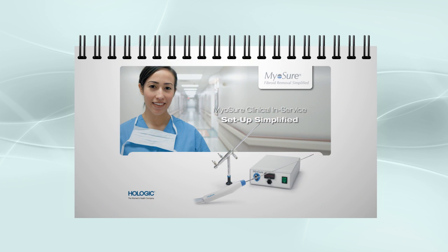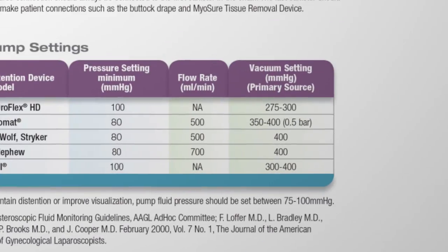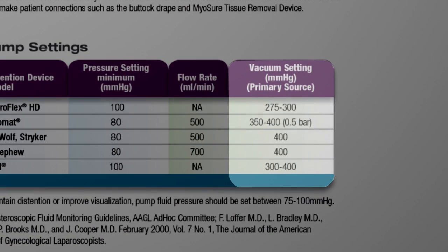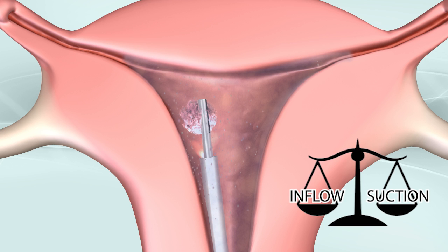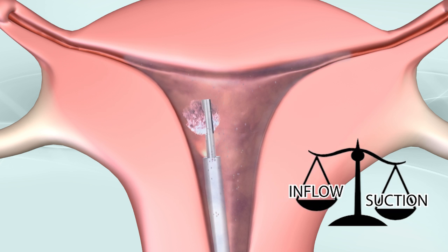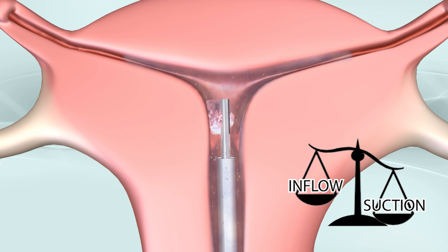It is important to set the vacuum pressure based on the recommendations in the Myosure setup guide. The vacuum pressure significantly affects uterine distention and cutting efficiency. If the vacuum is set too high, distention will deteriorate quickly when Myosure is activated.